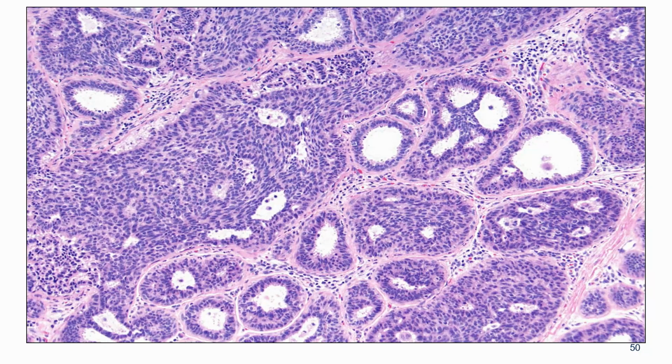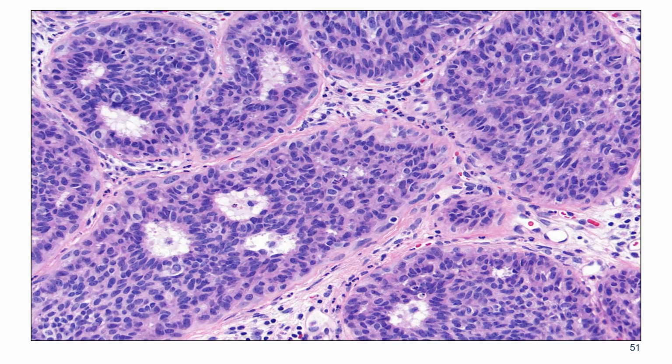Contrast that with this example, where again you have this streaming of the nuclei, which we think of for usual ductal hyperplasia. Even though the nuclei are more oval, which we think of for UDH, and there is streaming, I think there is a monotony and a similarity to the nuclear features of these cells. The polarization around spaces can be a little less dramatic in intermediate nuclear grade DCIS, so that can be more subtle.